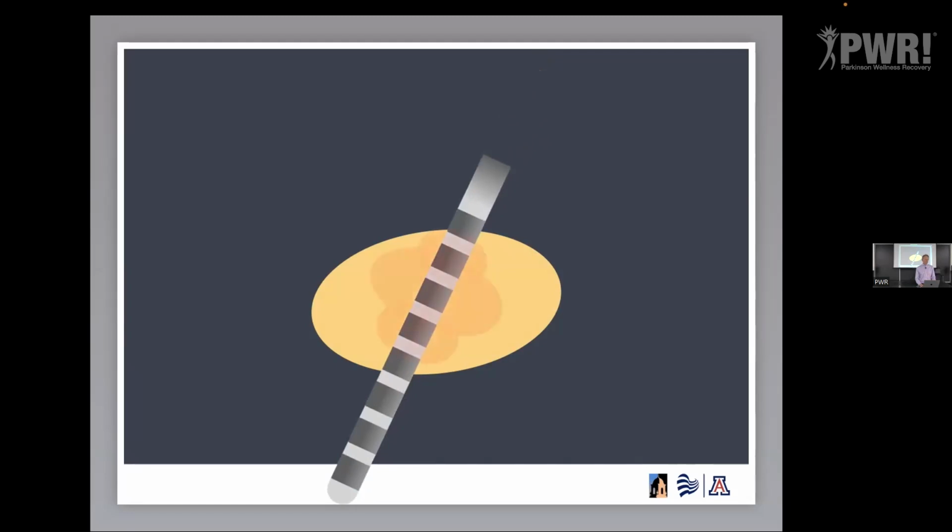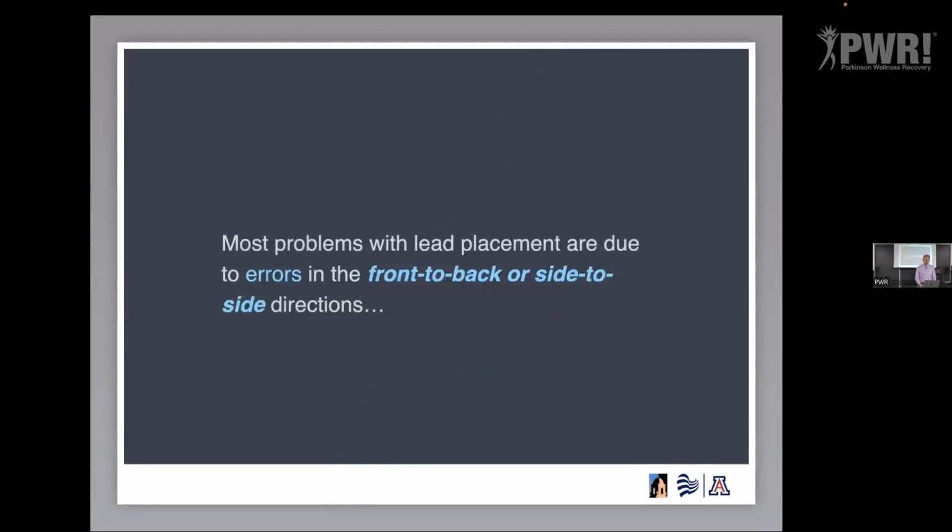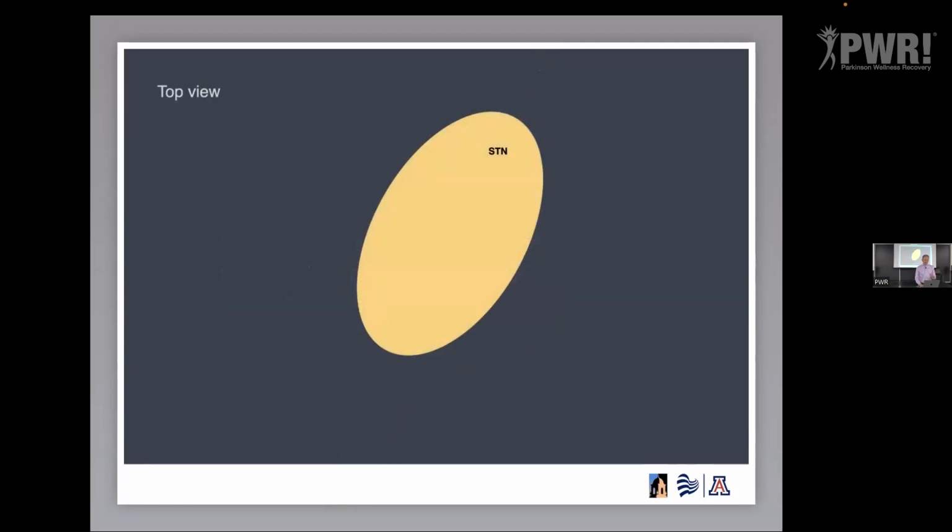We can just use the upper ones. So we have this ability to sort of shape current in the vertical direction along the electrode. That's helpful, but a more common problem is this. Here, now we're looking from the top down. So here's a lead or a DBS electrode that's in this structure.